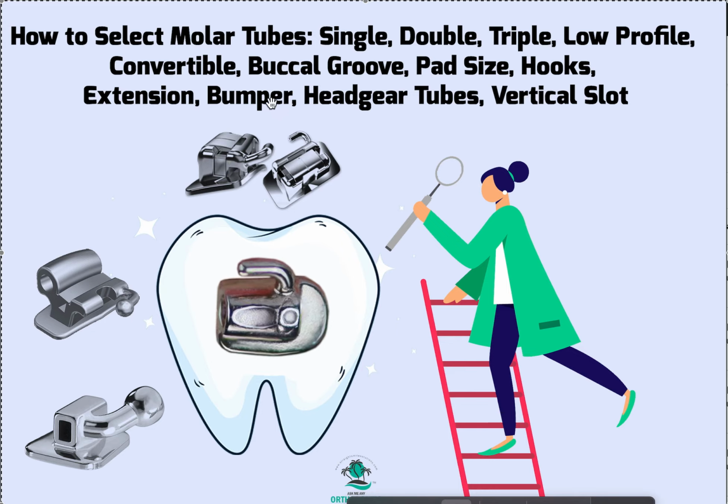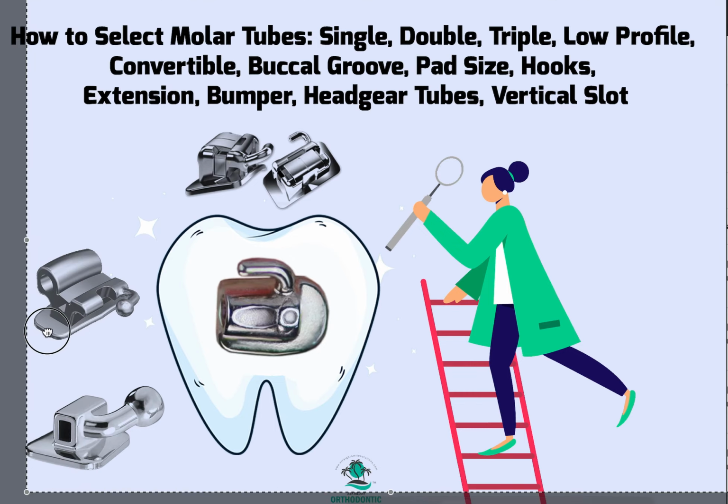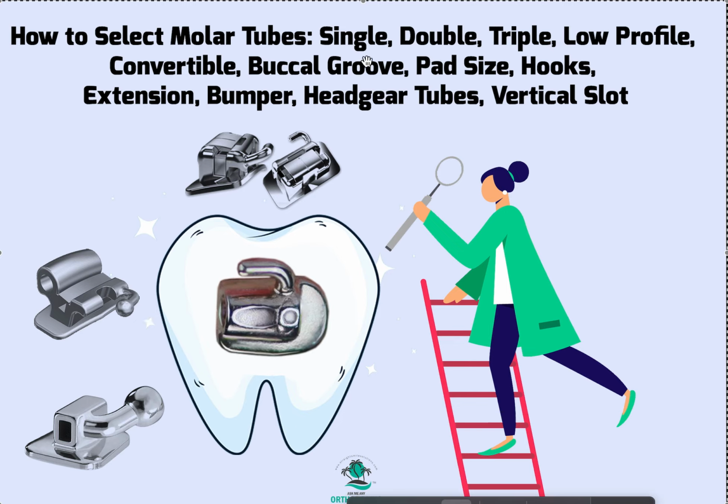Again, bumpers, yeah, we talked about bumpers. Extension is kind of like pad size, where it's just a little bit longer, so you have a little more surface to bond to. HeadGear tubes, we talked about that. And some of them have a vertical slot. That doesn't even make sense to me. I guess if you're doing tip edge, you need a vertical slot. I don't know.